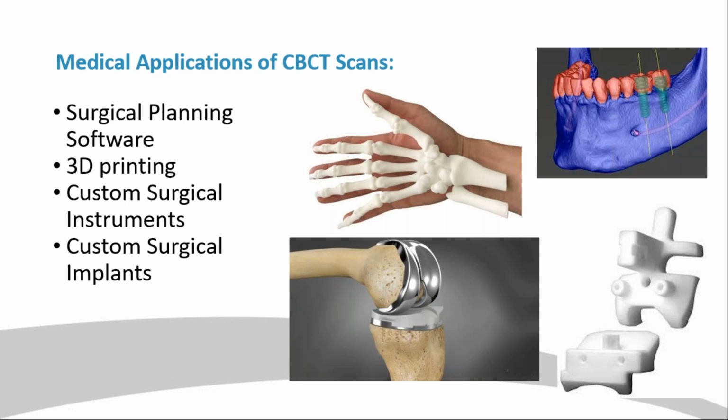And what this allows the doctors to do is they can use these custom cut guides to each patient's specific anatomy so that they're getting the perfect cut and the perfect position of these implants much more reliably, with a higher degree of repeatability as well, so that the patients get a better outcome.